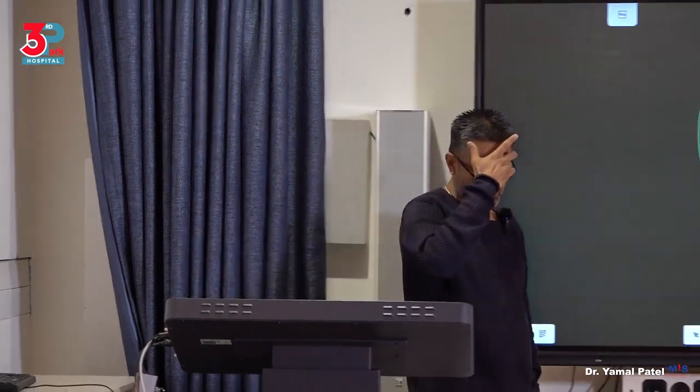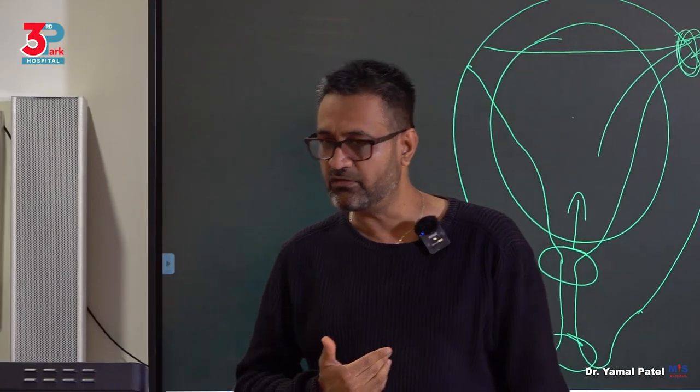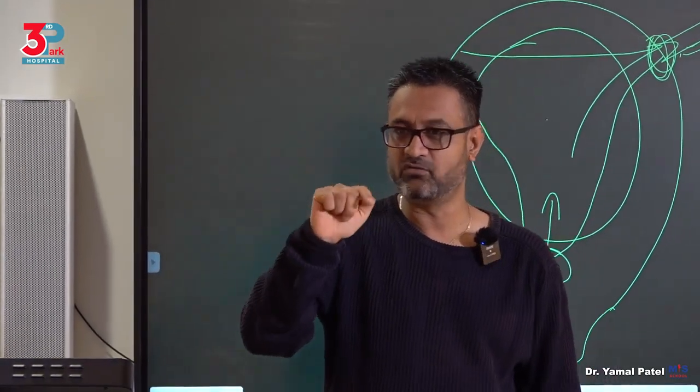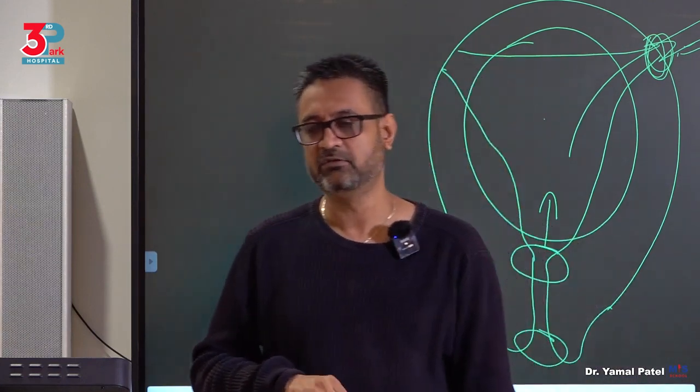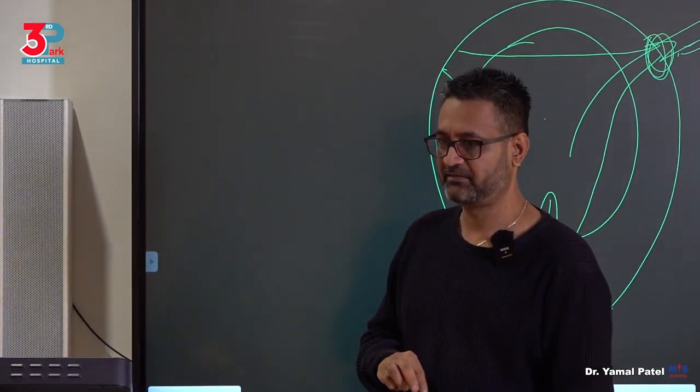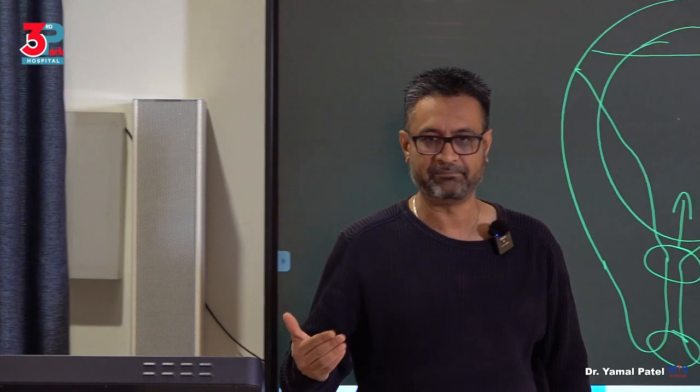And the guide we use is preferably below 100 millimeters of mercury. So put your setting max to 100, or work around the mean arterial pressure, the MAP. So what is mean arterial pressure? How is mean arterial pressure calculated? Yes. So that is the calculation of the MAP.